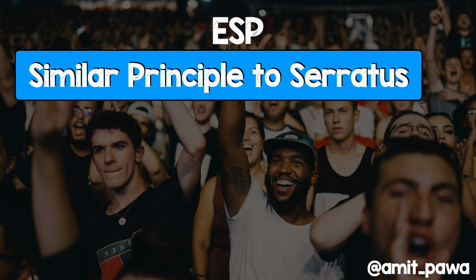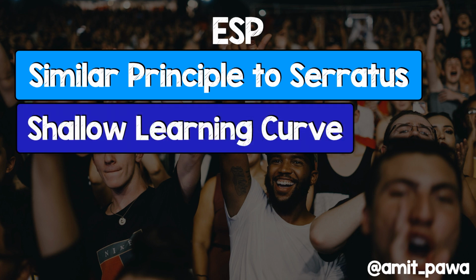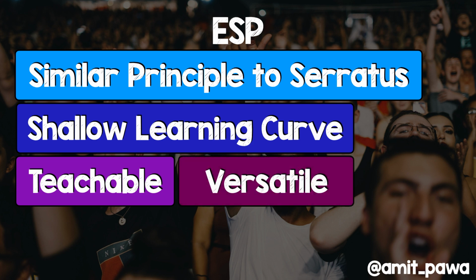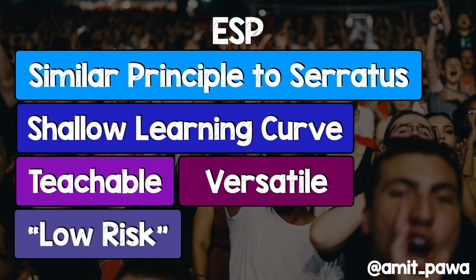Now, this is a similar principle to the serratus plane, so if you've learned how to do this one technique, you can take those skills and apply them to other blocks. It does have a shallow learning curve. Once you understand the nuances and the tips and tricks, it's relatively easy to learn and reproduce. It's also easily teachable. You've got some simple sonoanatomy to identify, and once you've mastered that, you can then use that knowledge to teach others. It's versatile, and as you will well be aware, it has been used for a whole host of other techniques, and it is low risk.